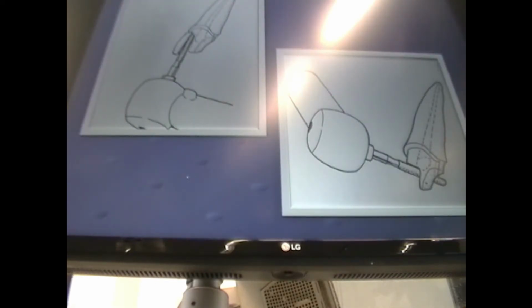Okay. Here Dr. Graves has illustrated the beginning of the post preparation. You see, first drawing, she's doing the axial preparation. All right, and you can see the dotted line where the pulp is, okay, the root canal space. The second picture, bottom right, you see where Dr. Graves is now accessing the pulpal tissue.